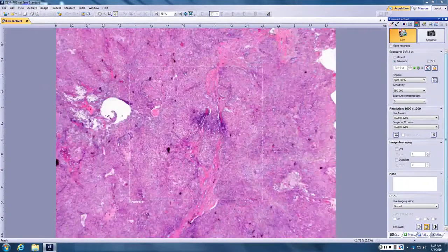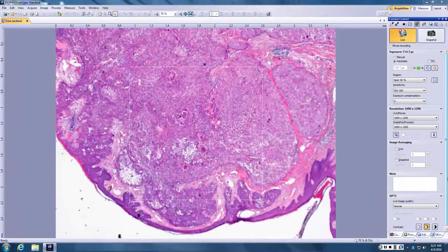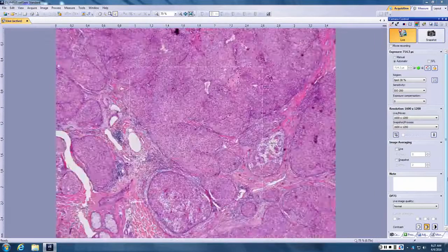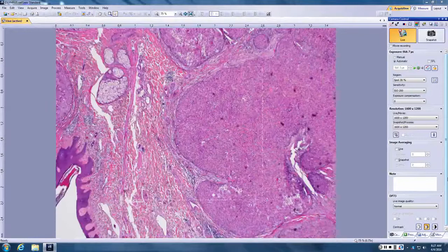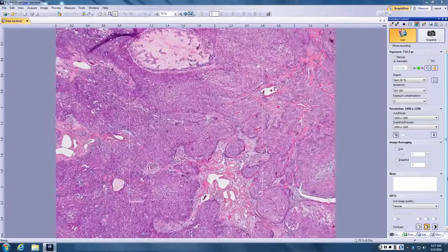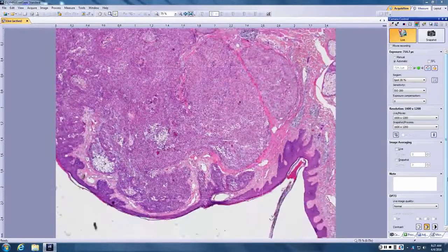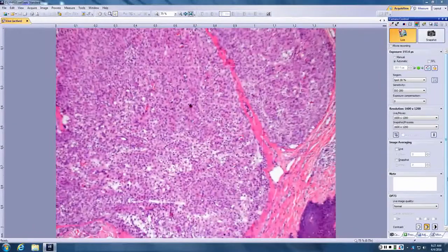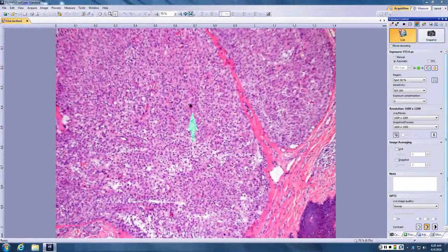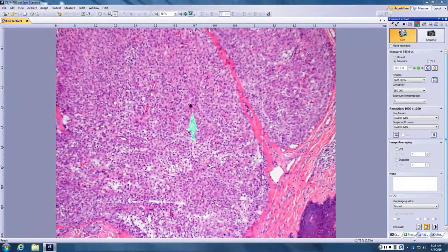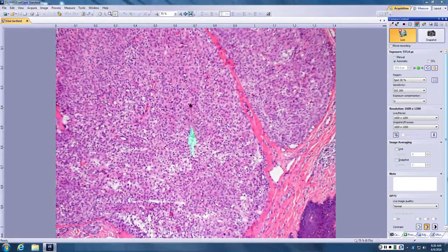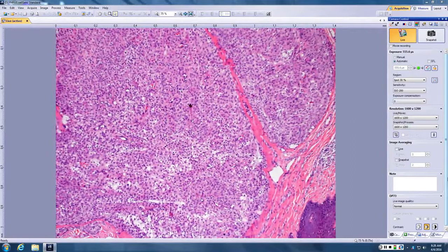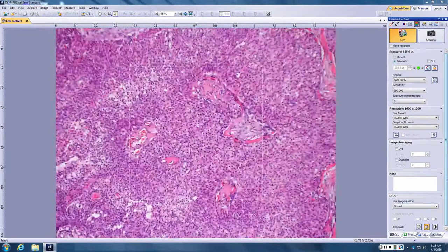Large nodule in the dermis. It's got some sclerotic stroma around it. It looks a little bit like a spiradenoma. It's quite like a spiradenoma, but there's some vacuolated cells here. Yeah, so a spiradenoma would have no cytoplasm, right, just three colors of gray to black cells. This one has plenty of pink cytoplasm and little round lumen-like spaces and doesn't palisade and has clear cell change. So it's poroma. Poroma, acrospiromas, clear cell hidradenoma group, very good.